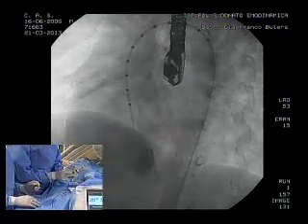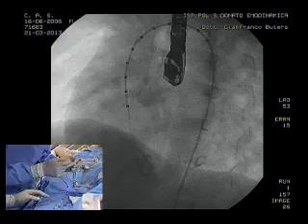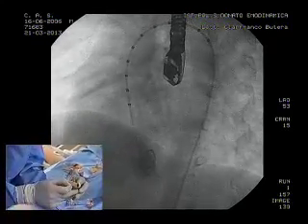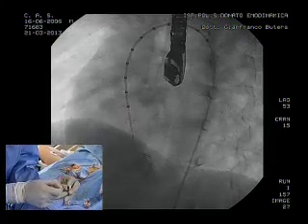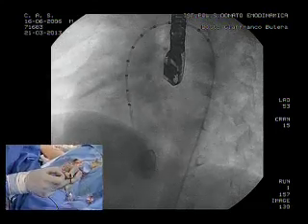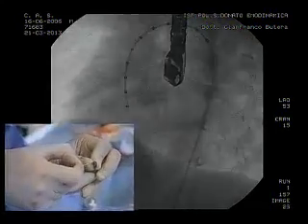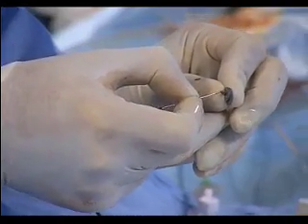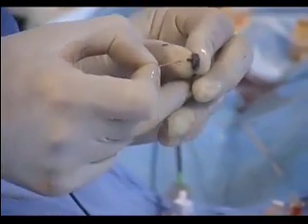So what we're going to do, can you zoom on my fingers, please? It's an ADO2 or an ADO2 AS, but not the old membranous one. Can you zoom here, please? And Gianfranco, rotate the pin vise clockwise. One second. Zoom. Clockwise.